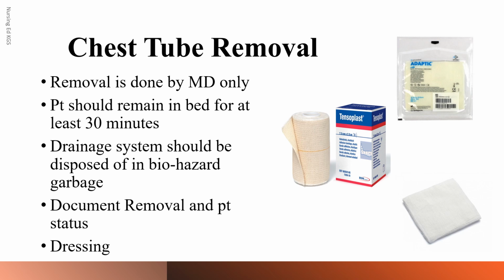and your non-sterile gloves. One of the major concerns with chest tube removal is developing a pneumothorax. And so after the chest tube is removed, as the primary nurse, you will observe for respiratory distress, subcutaneous emphysema, or bleeding from the site.